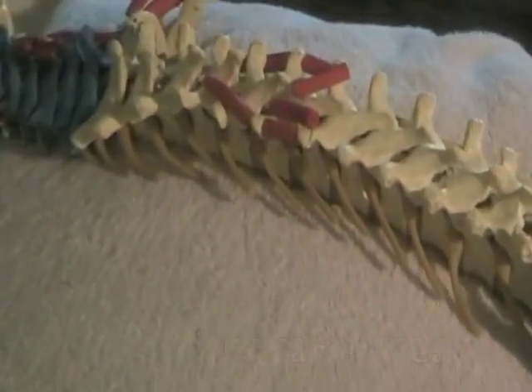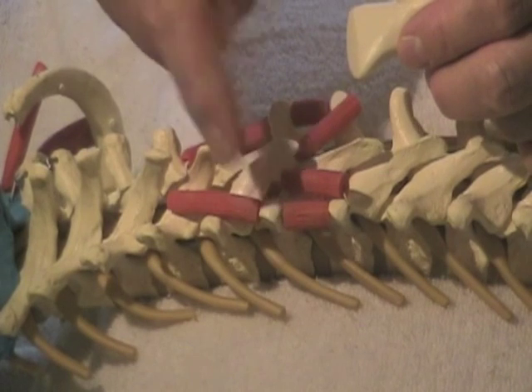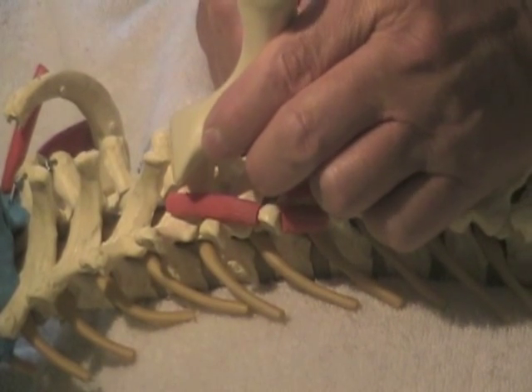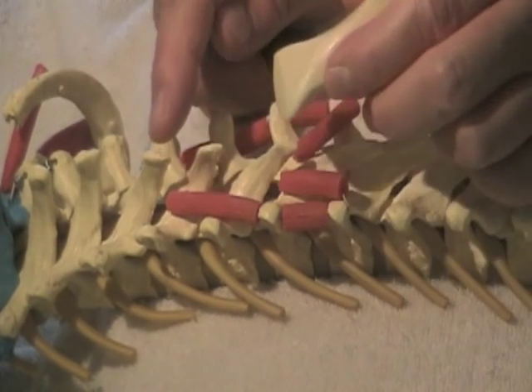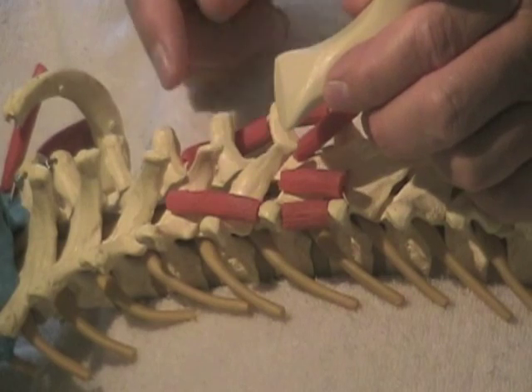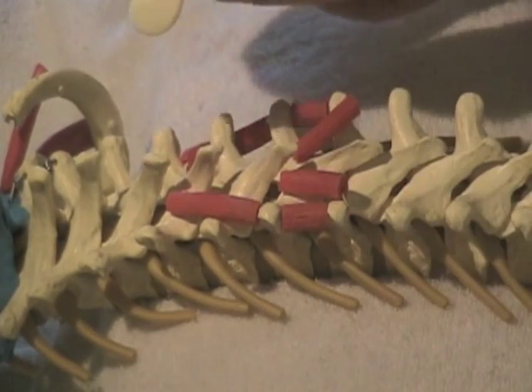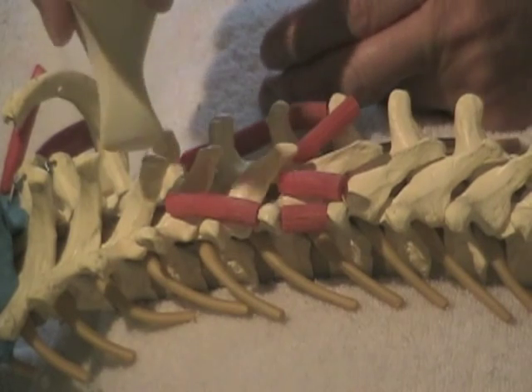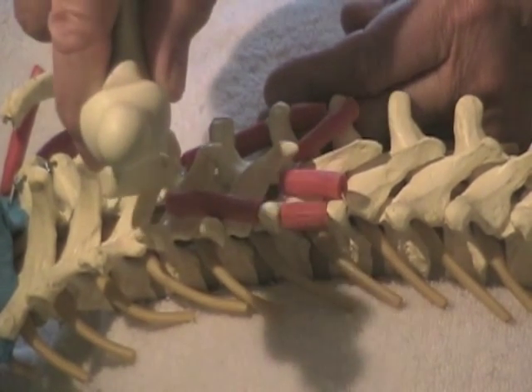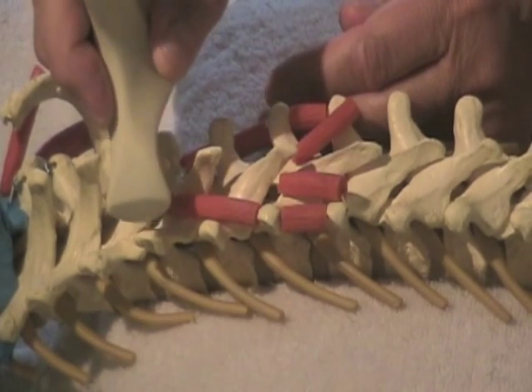Let me demonstrate how to use the L-bar. Here are the transverse processes and the spinous processes. You can get this little tool right in between the spinous processes to get those little ligaments, tendons, fascia, and periosteum. There are little rotator muscles. We can use this tip to get right on the edges of the spinous processes and transverse processes to get the periosteum and the little rotator insertions here.